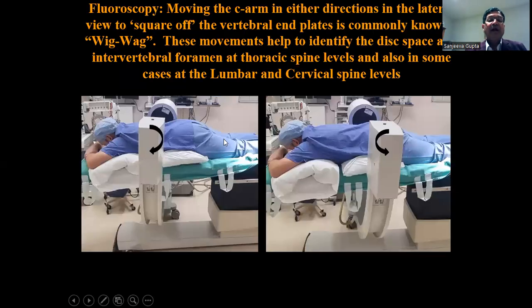So in the lateral view, sometimes the intervertebral foramina and the discs may not be crisp. So moving the C-arm in the lateral view in either direction, we call it wig-wag. Moving it either in this direction or in this direction. So basically, the whole C-arm goes like this or like this. Wig-wag, what we call commonly, can help to square the vertebral end plates and identify the disc space more crisply, as well as when you do that, the intervertebral foramina becomes much more visible.